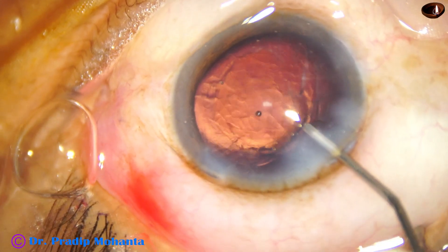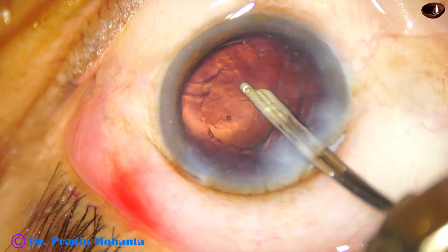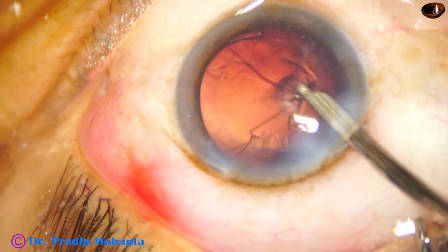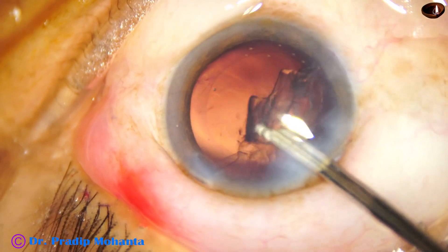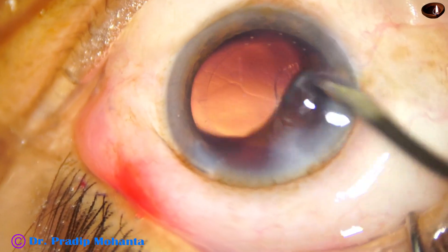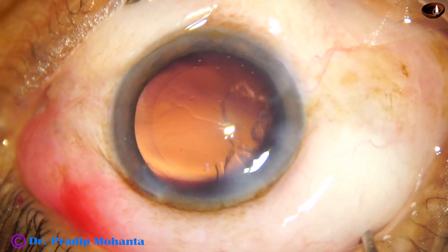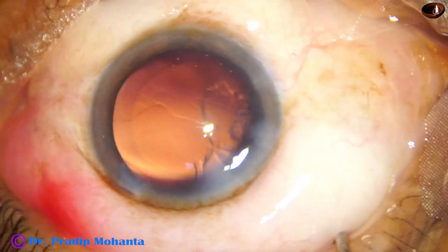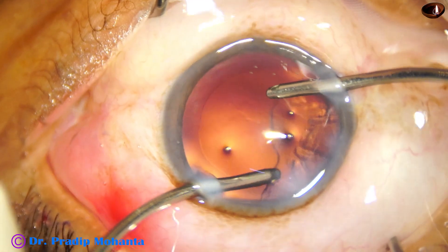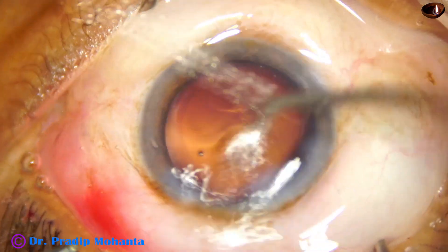Don't try to remove the cortex with the handpiece at this time. You can use Simco because you have used Simco for a long time — remove the cortex from the inferior aspect. Always inject Visco and keep the chamber filled so that the anterior chamber is maintained. Now try bimanual irrigation-aspiration for removal of the cortex from 9 o'clock to 12 o'clock. Irrigation goes, then aspiration goes — use the foot switch to go to position 2 (irrigation-aspiration position) and remove this cortex.